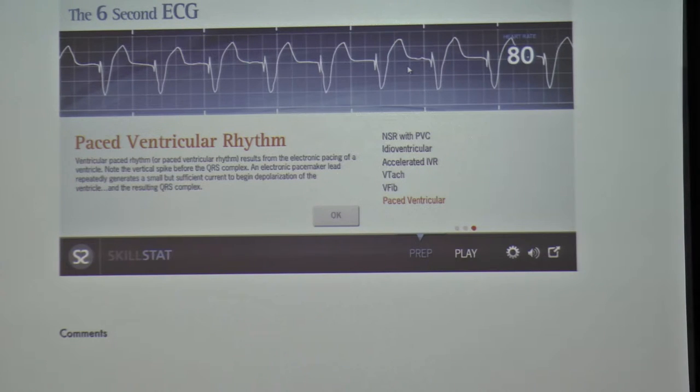But in this one, the ventricle would be filling via gravity. Right, unless there is atrial activity and we just don't see it because of something about the pacemaker. I'll be honest with you, I don't know enough about pacemakers to talk intelligently about it, but I could do some research. Because now they've got that pacemaker in place, maybe somehow it's masking the atrial activity or something like that. I don't know.